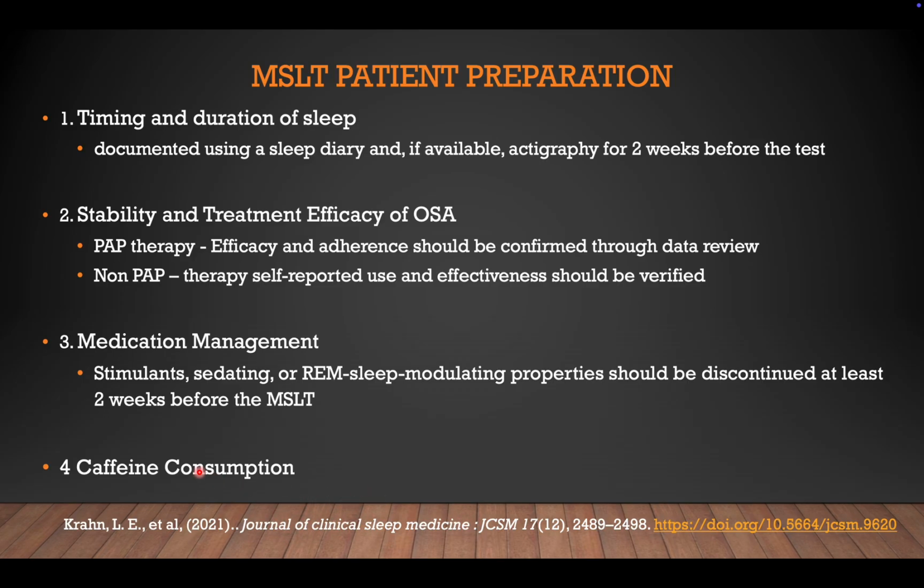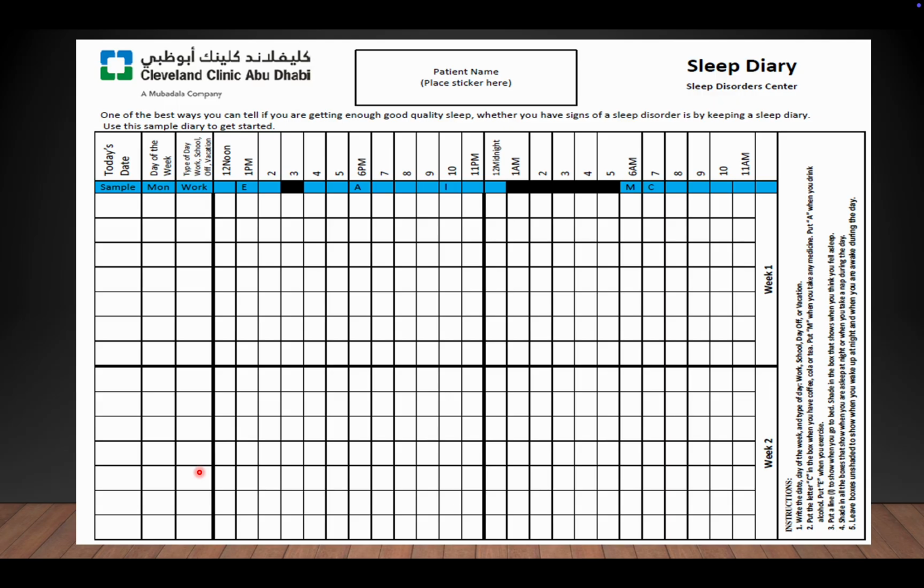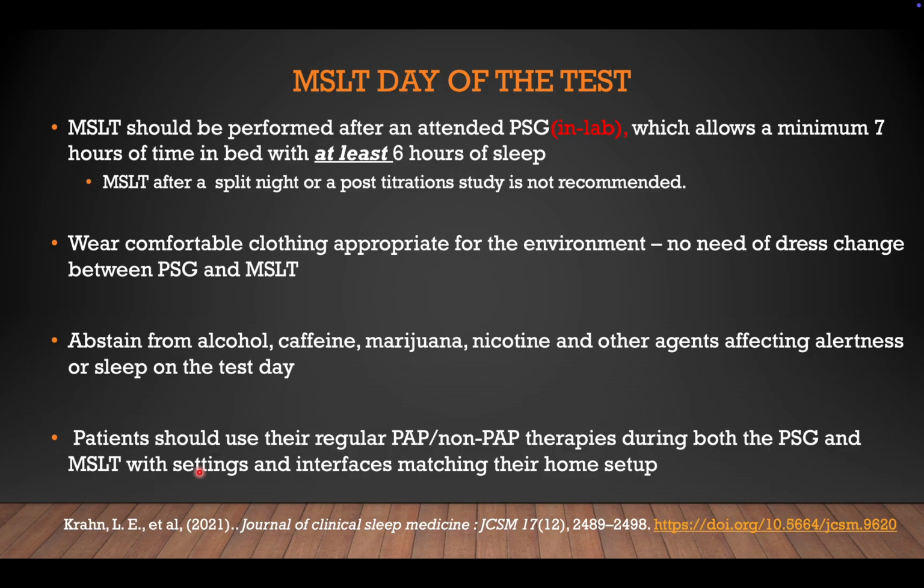MSLT and MWT. And this is an example of the sleep diary, where the patient has to document at what time he starts sleeping, at what time he woke up, at what time he has the coffee, tea, or when he does exercises and any other activities. And on the day of the test, or the night before the test, there should be an in-lab attended PSG, which allows a minimum of 7 hours of time in bed, or with at least 6 hours of sleep.